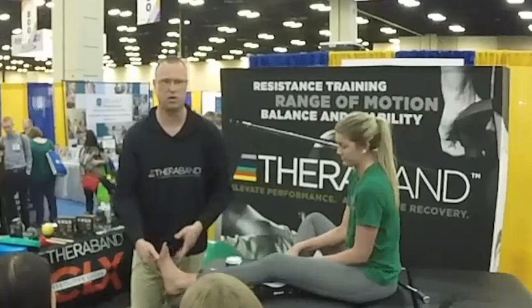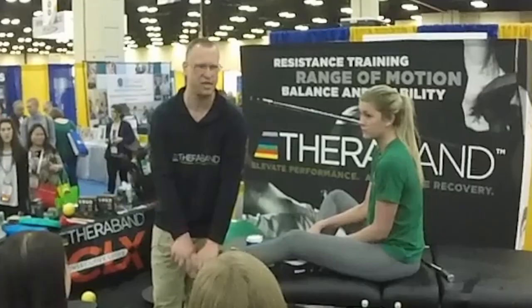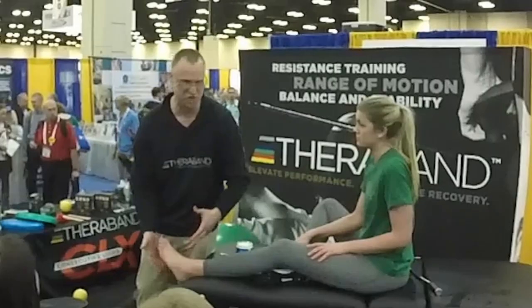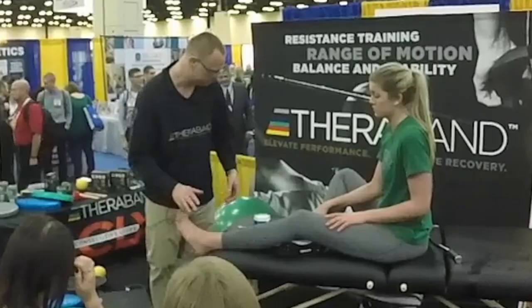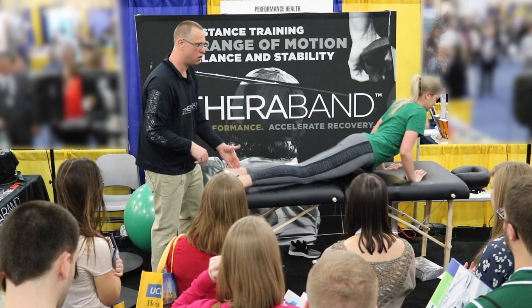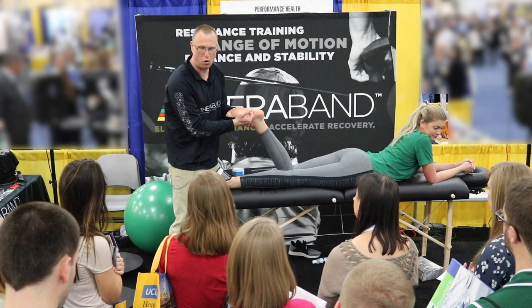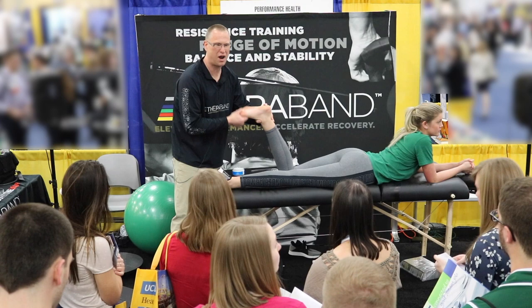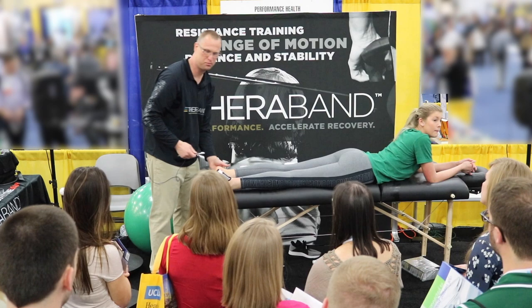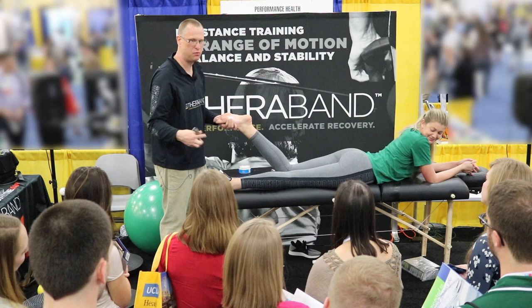For plantar fasciopathy, patients come in hurting when they're walking — not when they're lying on the table. So I ask myself: why are we treating them prone if that's not where they hurt? I do some soft tissue work in prone, working distally toward the rear foot. The mechanism of injury is the plantar fascia pulling off the anterior part of the rear foot. I'll work that area for maybe three to five minutes with the beveled edge, ensuring proper windlass mechanism and first ray extension.